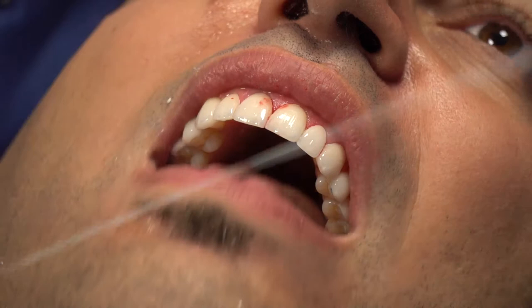I'm very, very happy with my smile. The color is perfect — without losing the natural look. Now that I have my Lumineers on, I think they've become a great advertising tool, because I can just smile and say, 'Do you want this? I can give them to you.' Impression, cement, adios. Can't get easier than that.